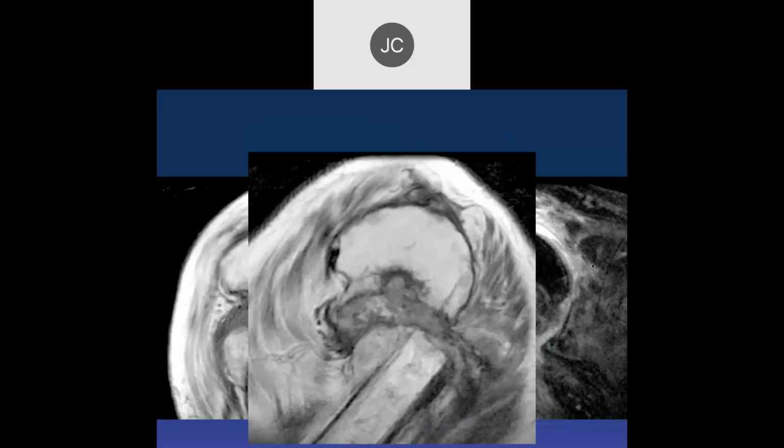All right, so a fracture of the proximal humerus and the humeral neck. You could certainly see a lot of atrophy of the muscles. This is probably primarily the surgical neck, and we can see that there's a lot of hypertrophic bone here. So this is really a chronic non-union in this patient.